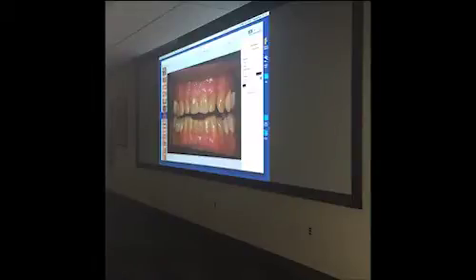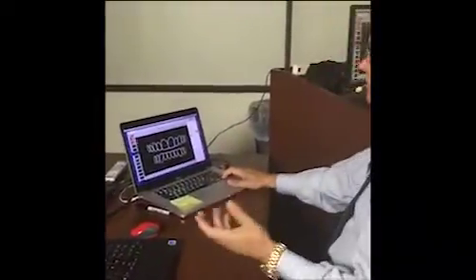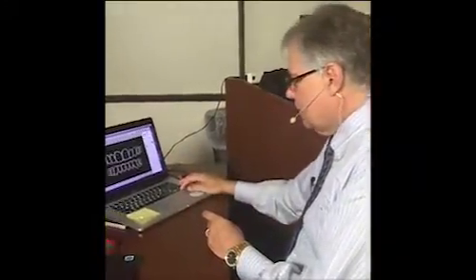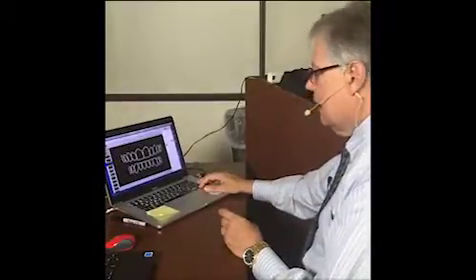So let's say that I want to figure out where teeth should be. Let's go get some teeth. If we look at these, I'm going to go over these in a bit with everybody. For those watching on Facebook, let's just say there's a number of different slides that have different shapes and different things. These are all the teeth. These are the originals. We used to use those 6 teeth. I drew this probably about 8 years ago. We've been using it ever since.